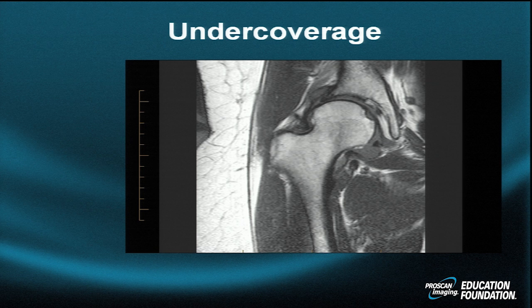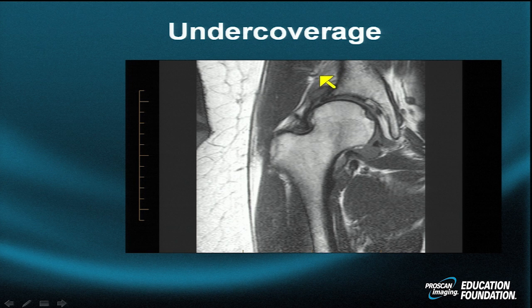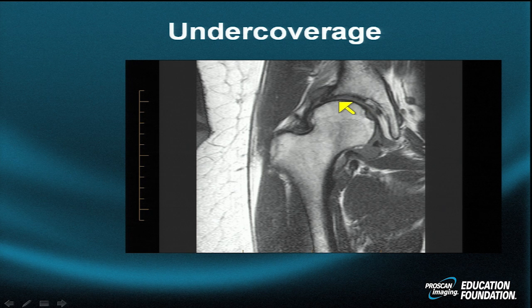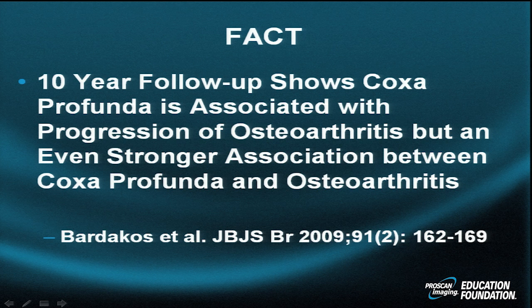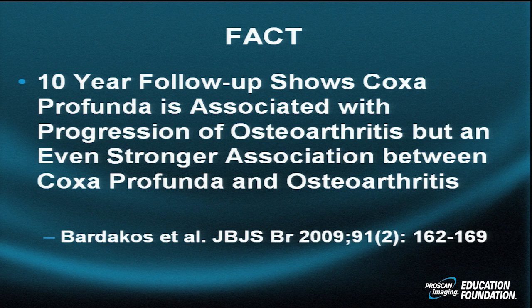The patient's symptoms are evident with muscles showing fatty infiltration and marked narrowing of the lateral joint space with loss of hyaline cartilage. A 10-year follow-up shows that coxa profunda is associated with progression of osteoarthritis, and an even stronger association between coxa profunda and osteoarthritis together is noted.